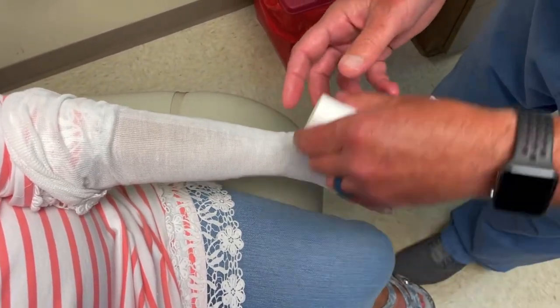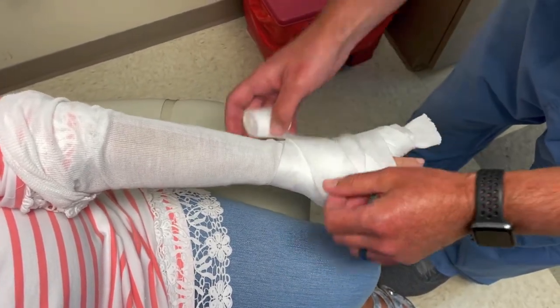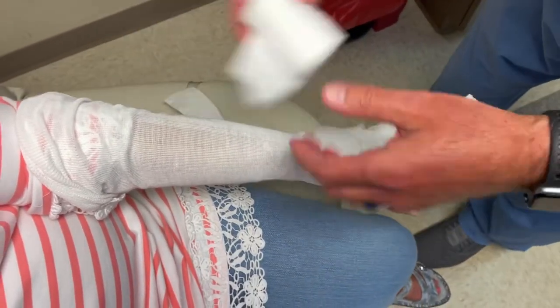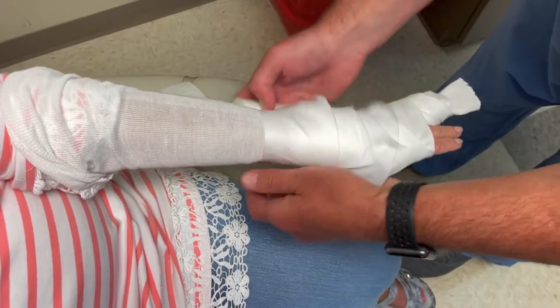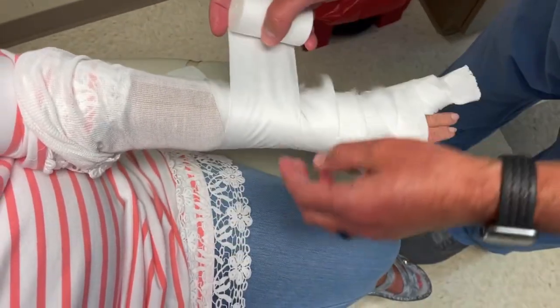This one's not gonna be huge but just make sure you're well padded around the thumb. See how I'm tearing it as I go — you don't have to go around and around, you can tear it just like tape. And now I'm gonna go up the arm. If you don't like the angle you can kind of adjust it like this — you can make it go where you want it to.